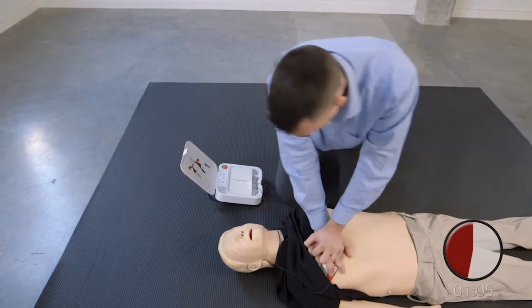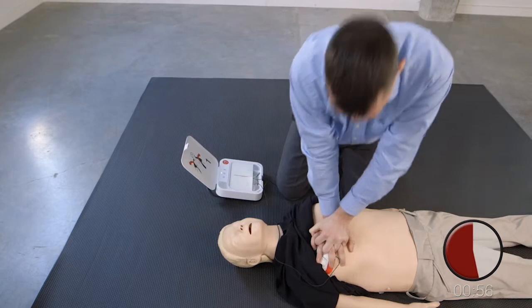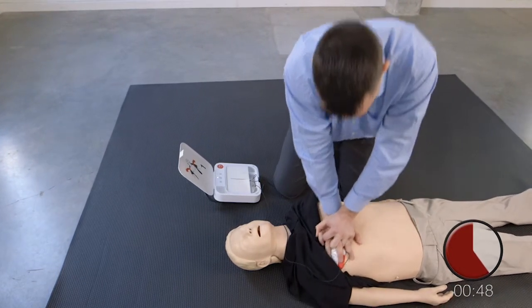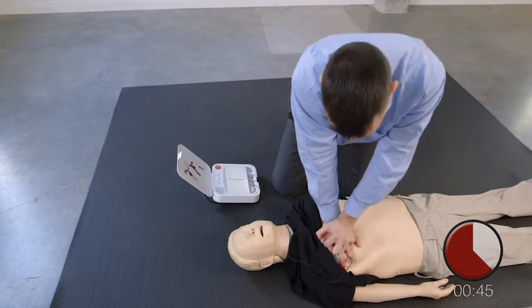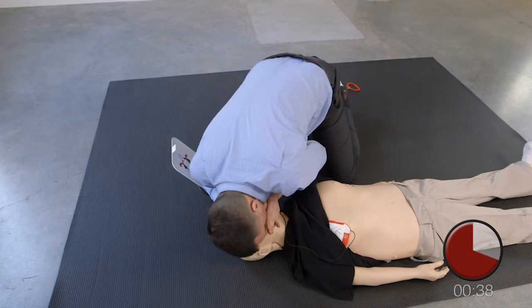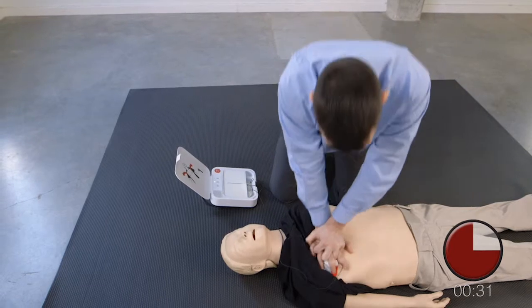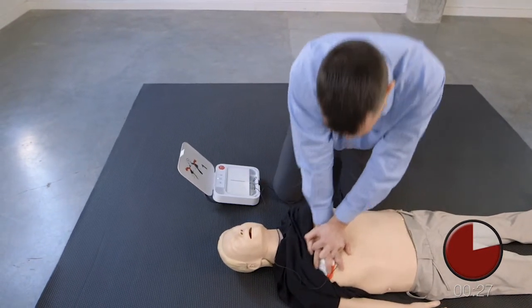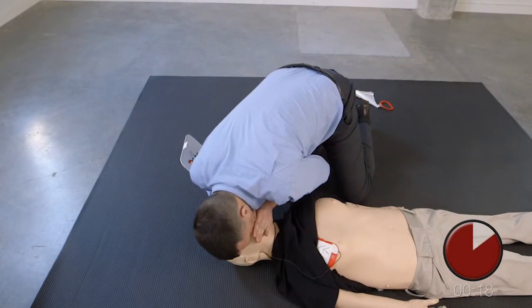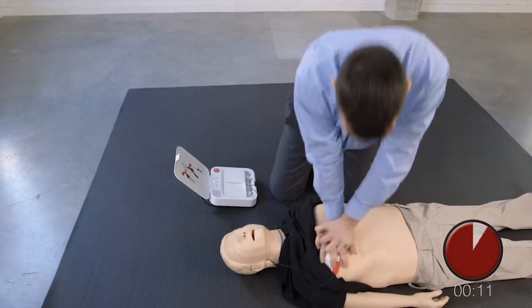Push down hard at least 5 centimetres. 1, 2, 3, 4, 5, 6. Provide two breaths, one, two. Resume chest compressions. Push down hard at least five centimetres. Provide two breaths, one, two. Resume chest compressions. Push down hard at least five centimetres.